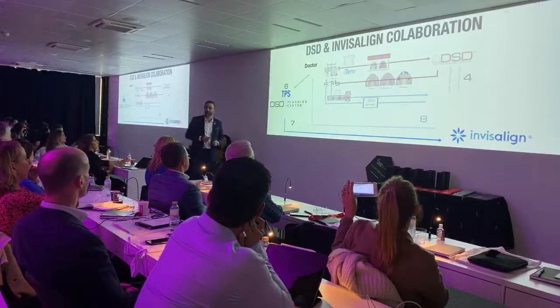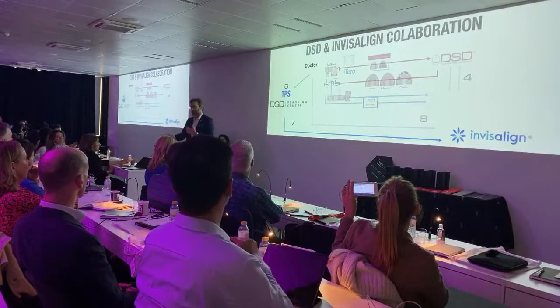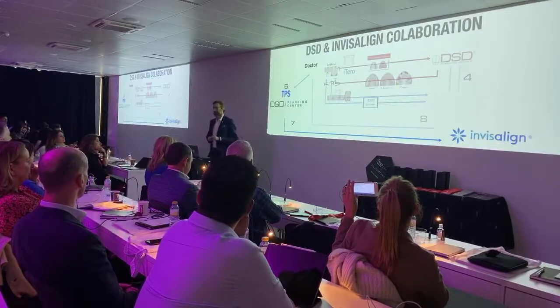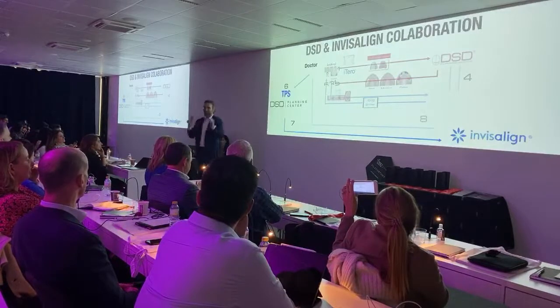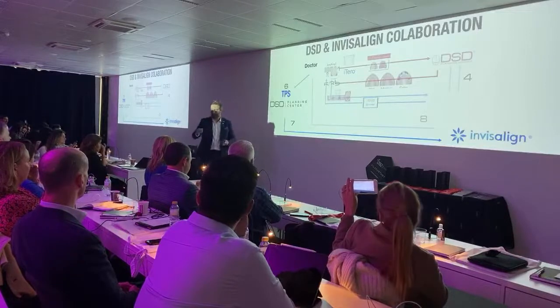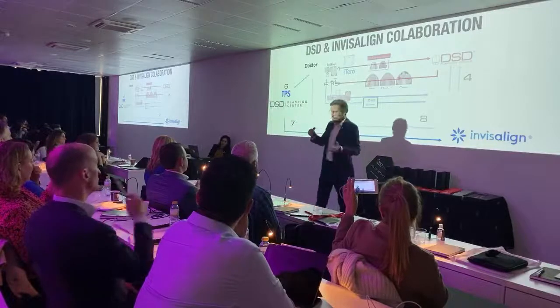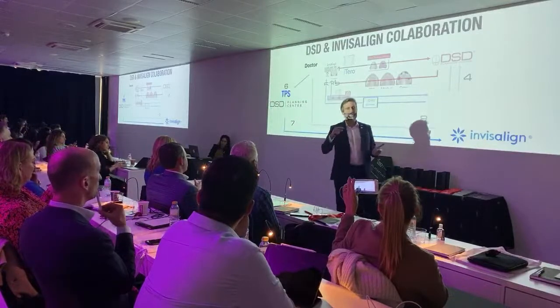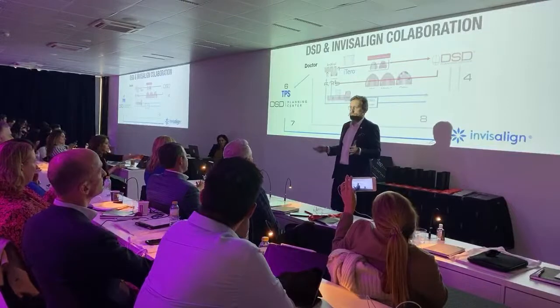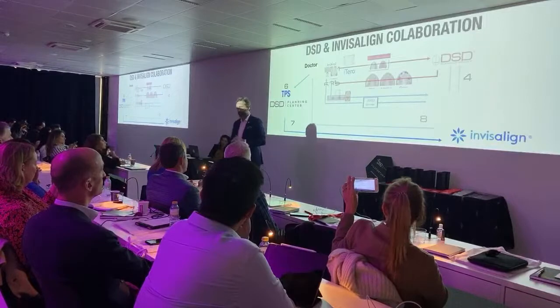I know it's a great tool to communicate a proposal. Maybe you were using it a lot, even before sending to Invisalign, to really explain to the patient. For that, you still have the option of the interdisciplinary. The interdisciplinary has always been the option for this. Whenever you need to treatment plan, or have information to treatment plan and communicate with your patient, explaining the treatment before case acceptance, the best option by far is the complete interdisciplinary option. And the ortho simulation will always be there.